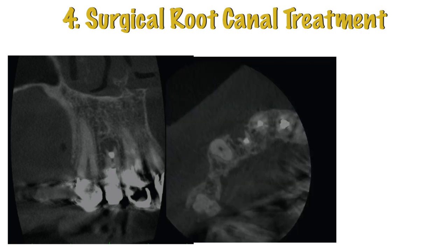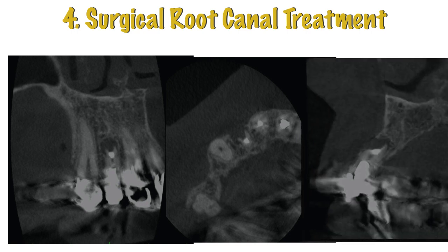Axial view, there's no buccal cortical bone. And the tooth was cut in an odd shape there. You can see the material that was used there. This is a sagittal view. So there's more tooth on the lingual than there is on the buccal, because this is the way the tooth used to be cut in the past for apical surgeries.